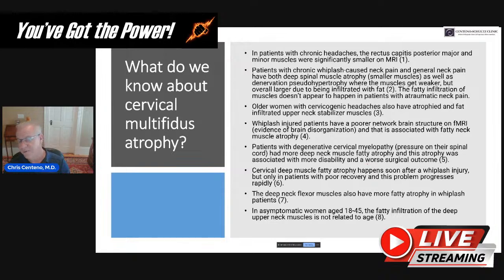This kind of atrophy is also seen when you have an irritated nerve.